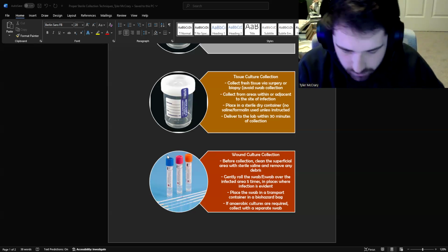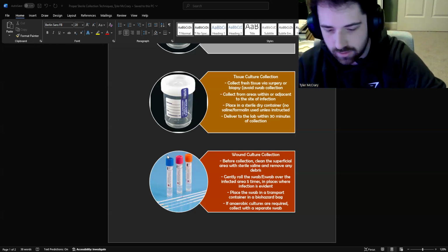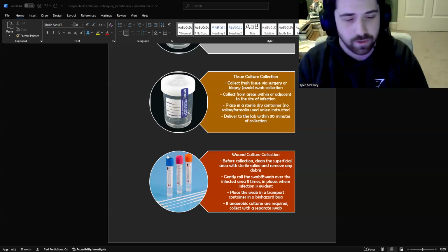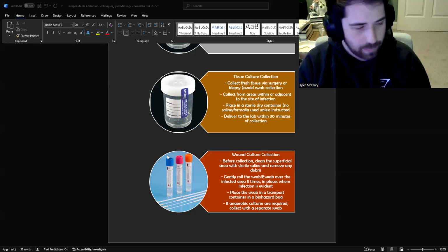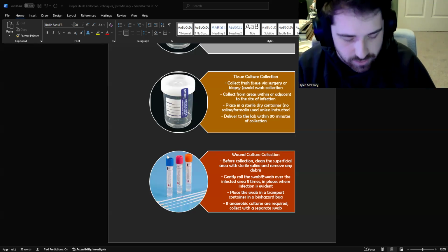So I also have some ways of how it should not be done. These are just standard wooden applicator tips. You can really use them for anything, but you cannot use them for culture collection because first of all, these are not sterile. These just come in a box. There's no way of sterilization inside.